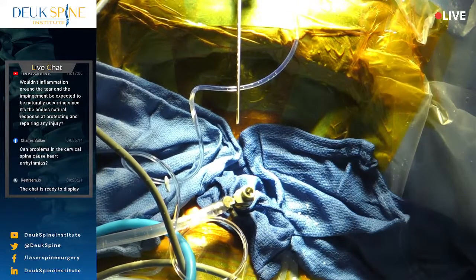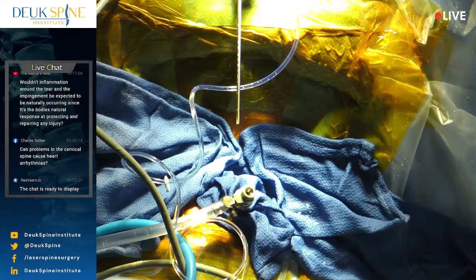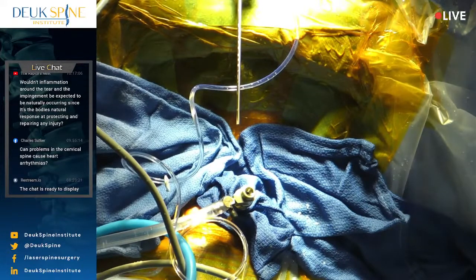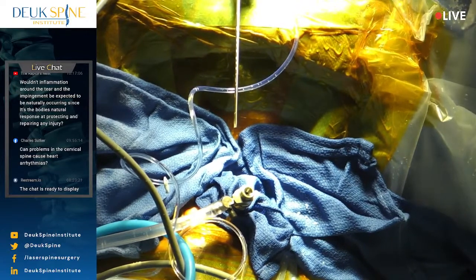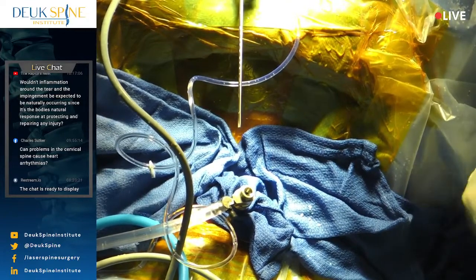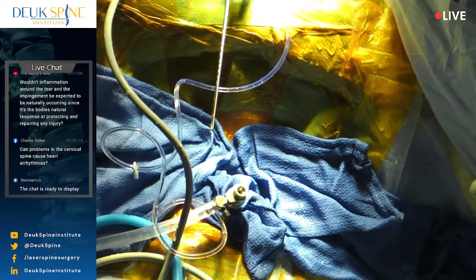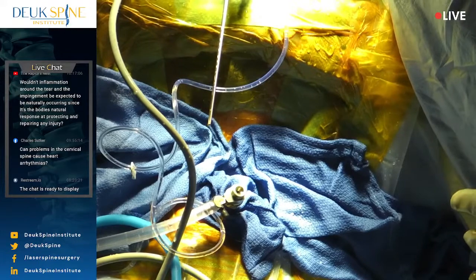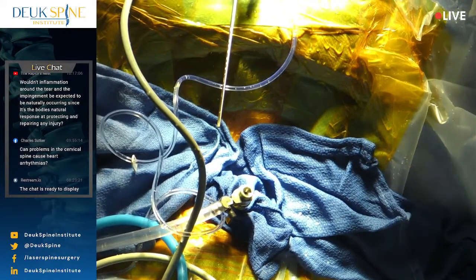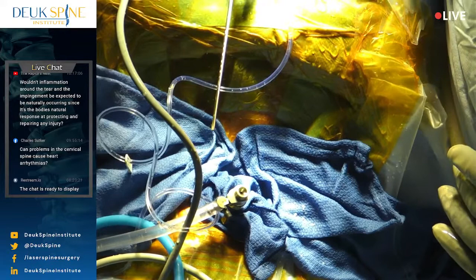So the issue we're having is the fibers that are glued together inside this scope have shifted. The reason they shift is the glue that's holding them in place is probably failed, which it always does. It's very well known, but it just seems to be potentially failing more frequently than I wanted to, which of course I never wanted to fail, but in reality, these scopes have to be re-glued. They call it maintenance. We maintain them, obviously, but whenever the lens and the image shifts to a blurry image, that means that the glue has failed and the scope needs to be reconfigured, rebuilt, etc. So that's what happened to our original scope. We just changed it. We got a good image now.